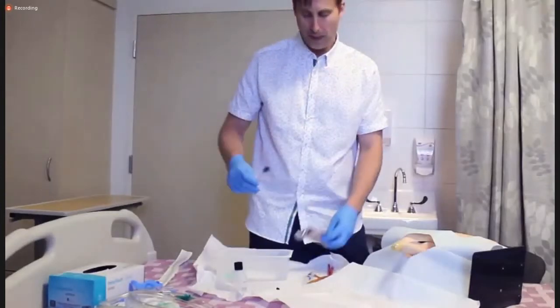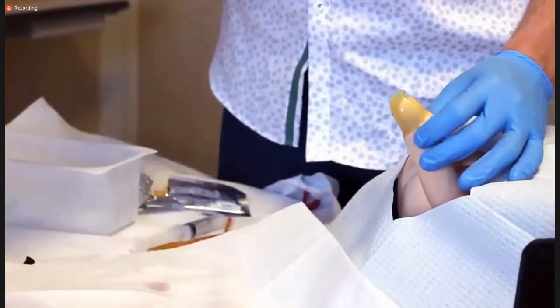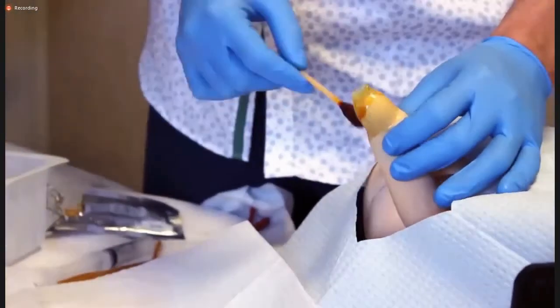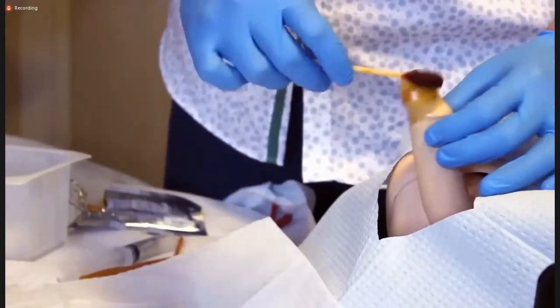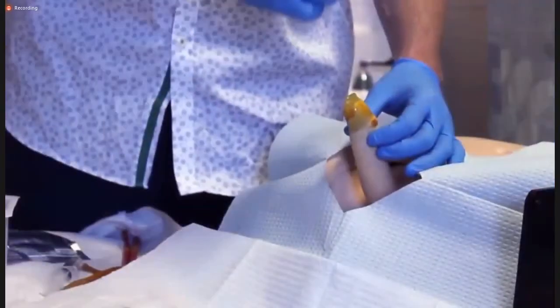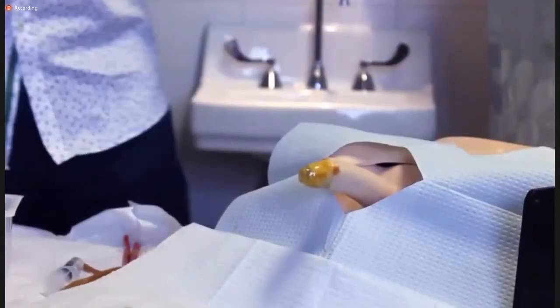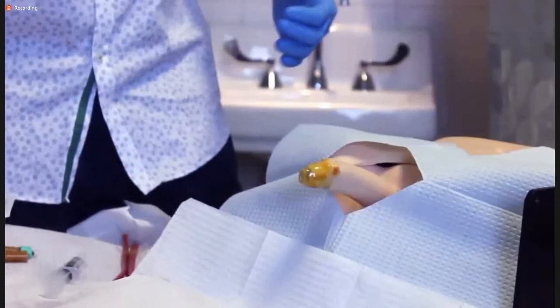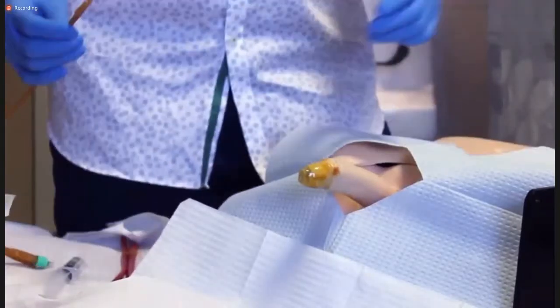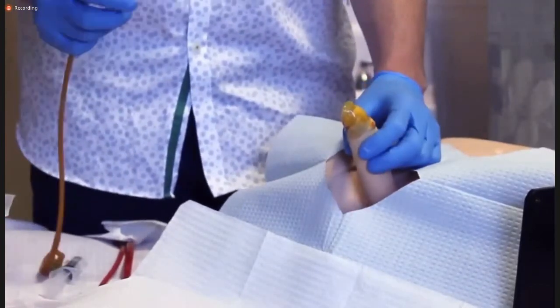Once you've established your sterile field, you can do this either before or after, we'll obtain our swabs. And what we will do is then, with one hand, which is now a little bit contaminated, take the swab with the other, and we'll dab it around the urethral opening and the rest of the penis. Now, you don't have to sterilize the whole area, but obviously the part that you will be placing the catheter through. Once you've done this, usually 2 or 3 times, you can place your swabs to the side, and then you can take your catheter. Make sure it's well lubricated with all the lubrication that you can get. And then you can start the process of placing the catheter. Obviously, the whole time, you're reassuring the patient that everything's going to be okay.